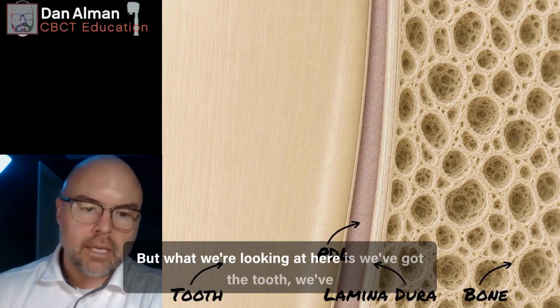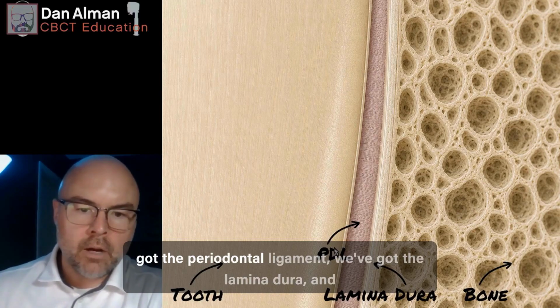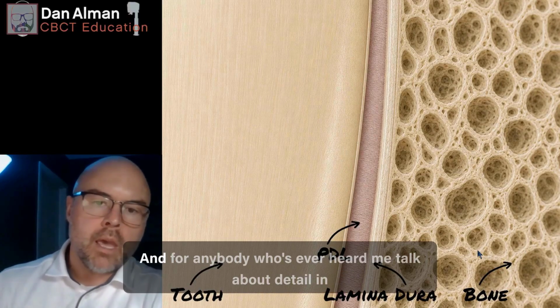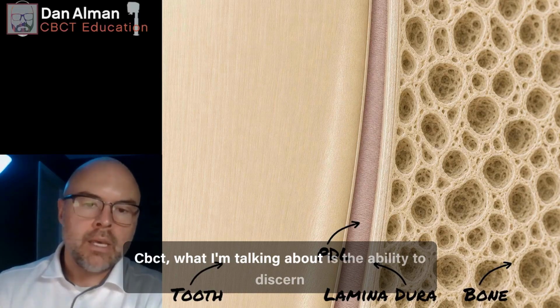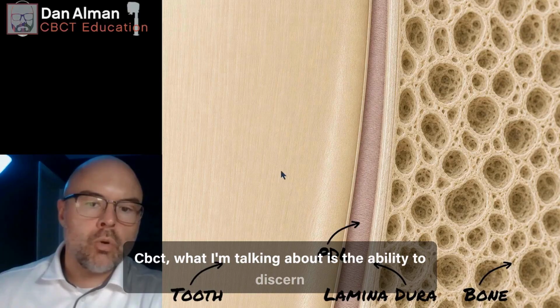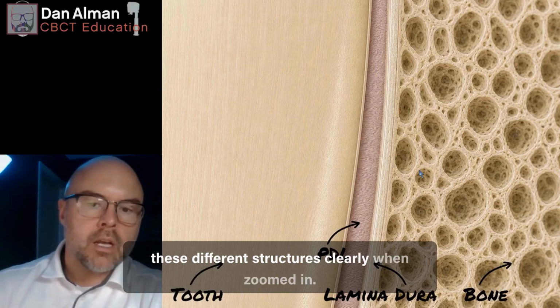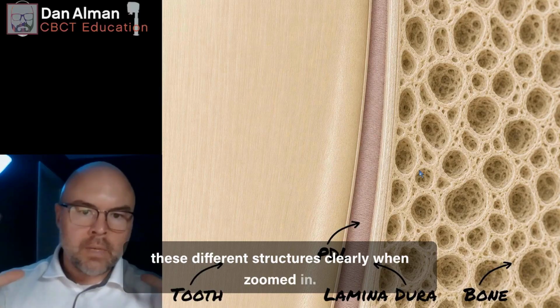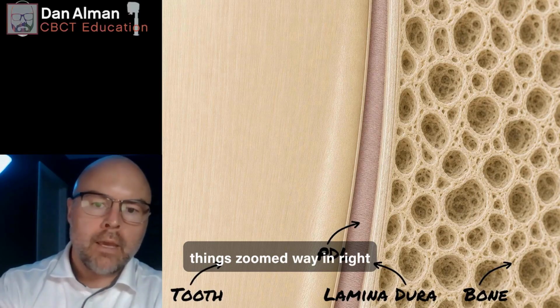But what we're looking at here is we've got the tooth, we've got the periodontal ligament, we've got the lamina dura, and we've got the bone. And for anybody who's ever heard me talk about detail in CBCT, what I'm talking about is the ability to discern these different structures clearly when zoomed in. Okay. So that's why we've got things zoomed way in right here.